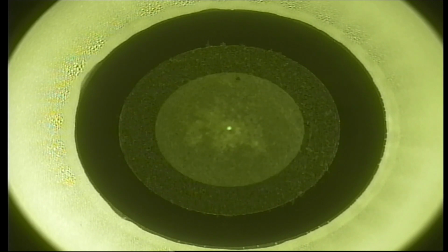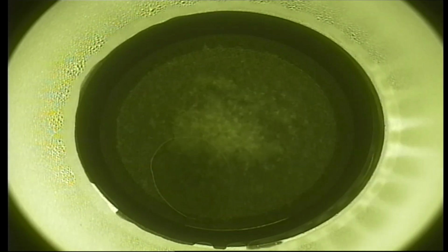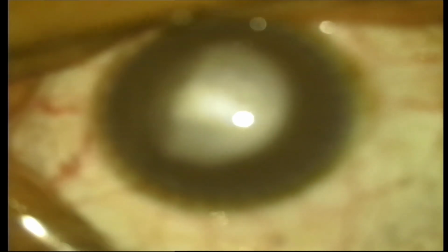After the posterior of the lenticule, this is the anterior of the lenticule, and this is a 3 millimeter. This is much bigger than 3 millimeter. Is it 4? Anyway, I normally have a 3 millimeter. I think it's 4 millimeter they kept, but anyway, it doesn't matter. So the machine says safe distance. This is at 90 degrees, and you can see that now the microscope automatically comes on.